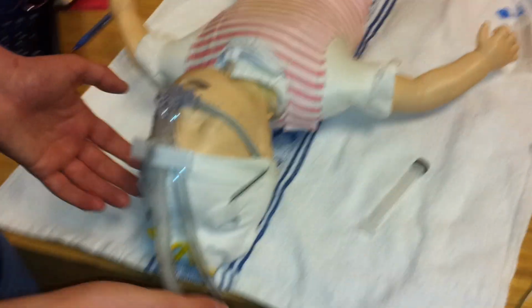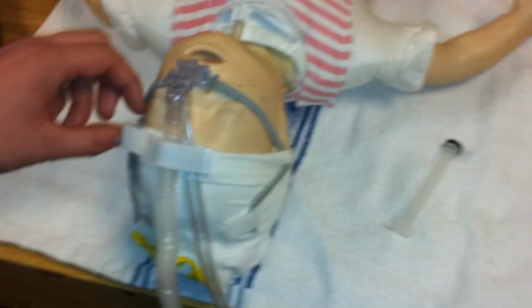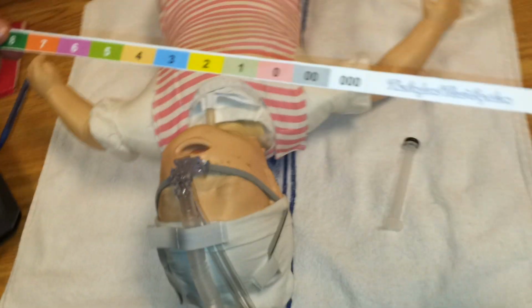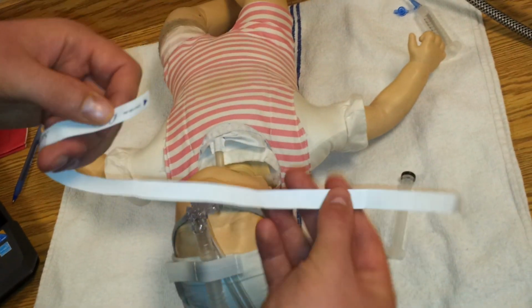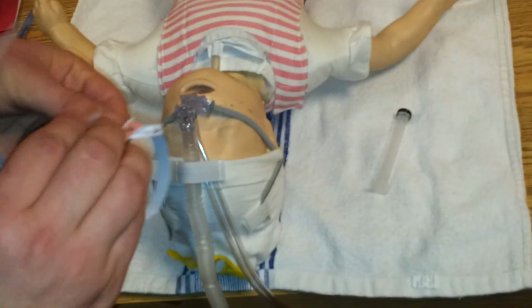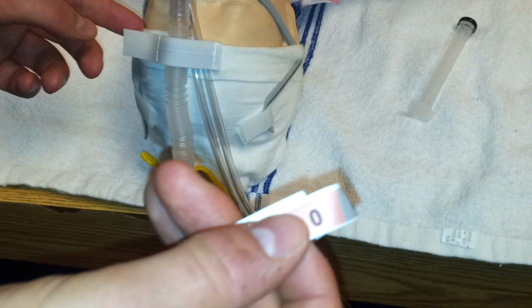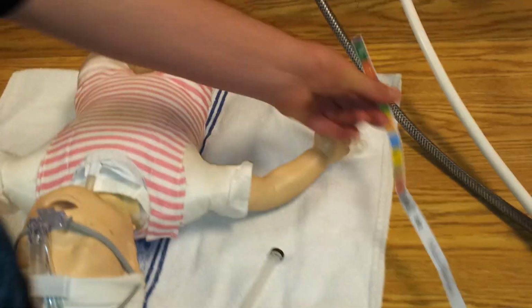And with the infant flow system like we're using now, it comes with a little hat to hook the nasal CPAP system up. They come with a little measuring tape like this, so you measure around the baby's head, and whichever color it comes to, that's what size hat you would use. That part's pretty easy.